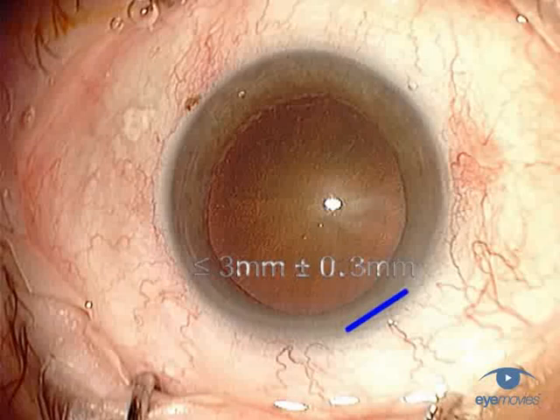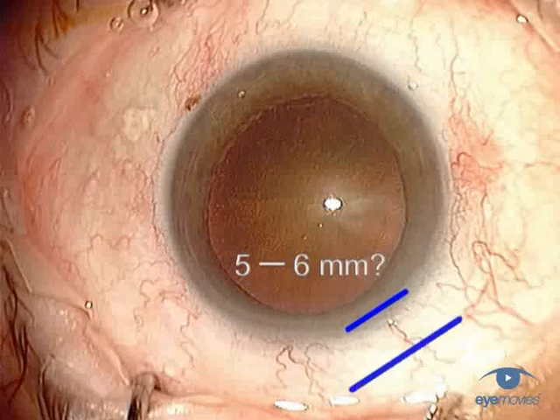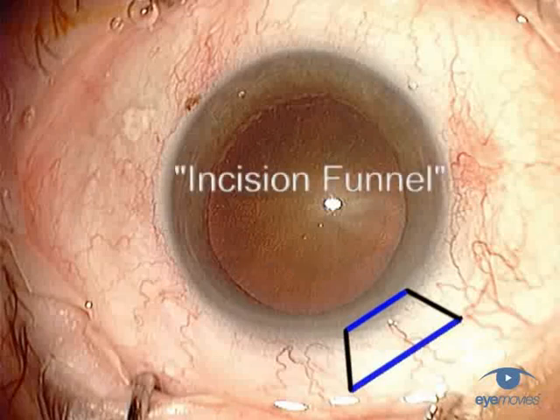If you need to make a larger 5 or 6 mm incision for any reason, then you'll need to move it 2 mm back onto the sclera if you want to keep it neutral. Connecting the ends of these two incision lines defines the astigmatically neutral incision funnel. Any incision placed within its boundaries is neutral. So first of all, think about how the incision width can affect the choice of its position relative to the limbus.